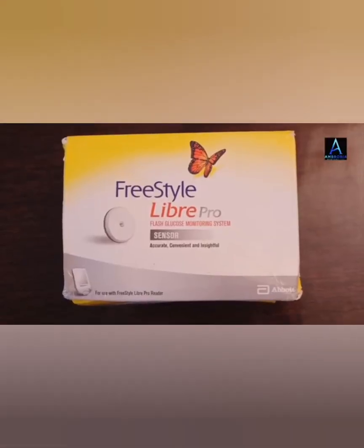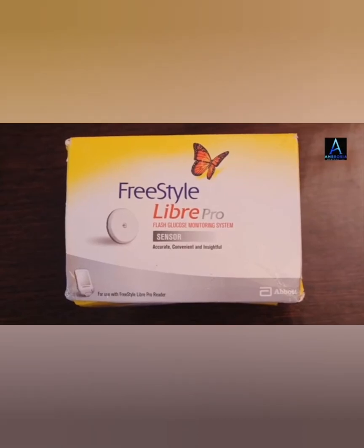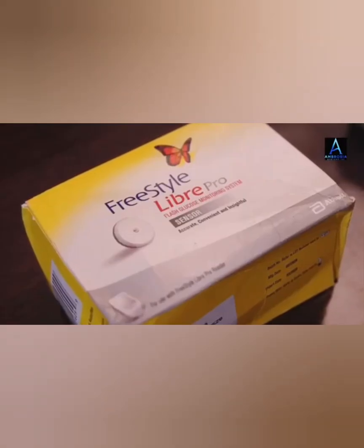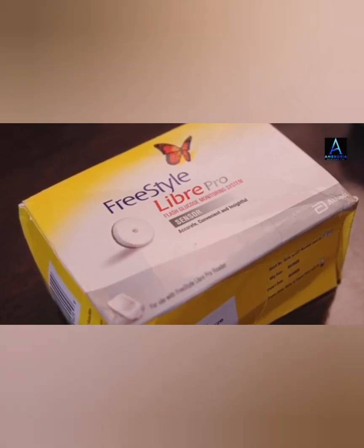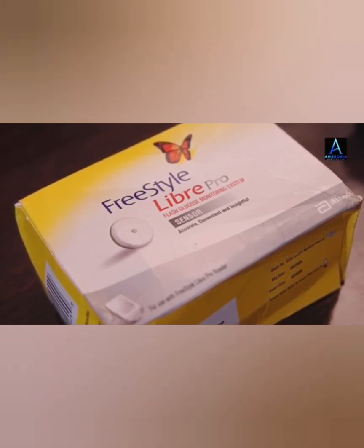So now I will be giving you a demonstration about how to apply the Libre Pro Sensor. The Freestyle Libre Pro Flash Glucose Monitoring System is a professional continuous glucose monitoring device indicated for detecting trends and tracking patterns in patients.